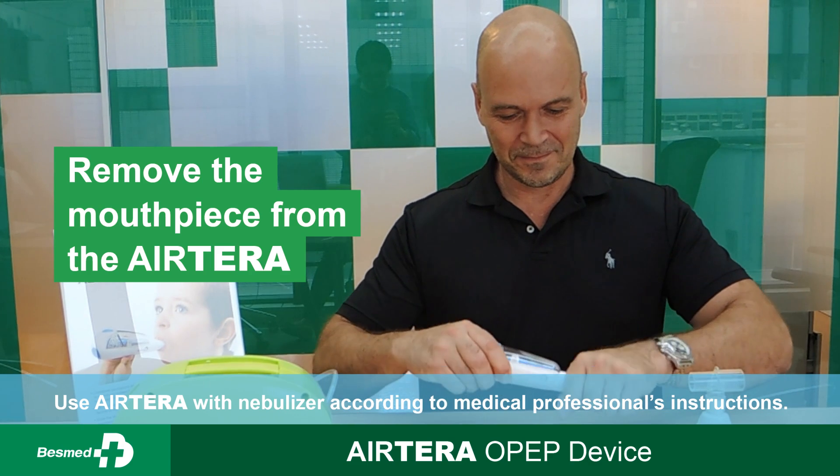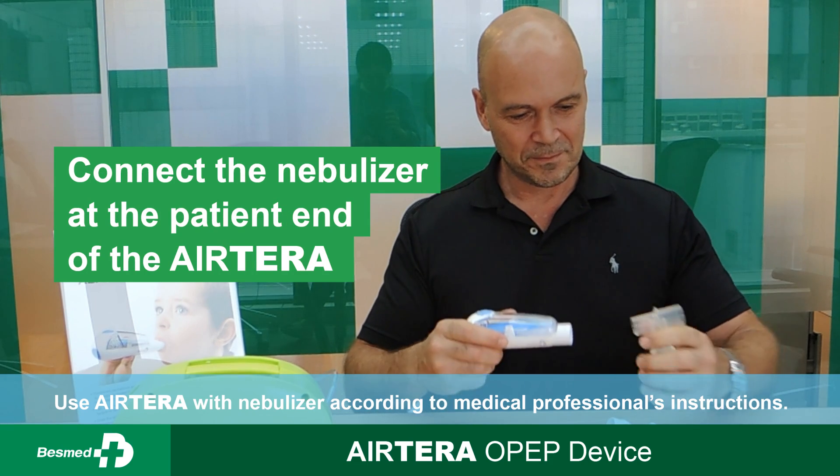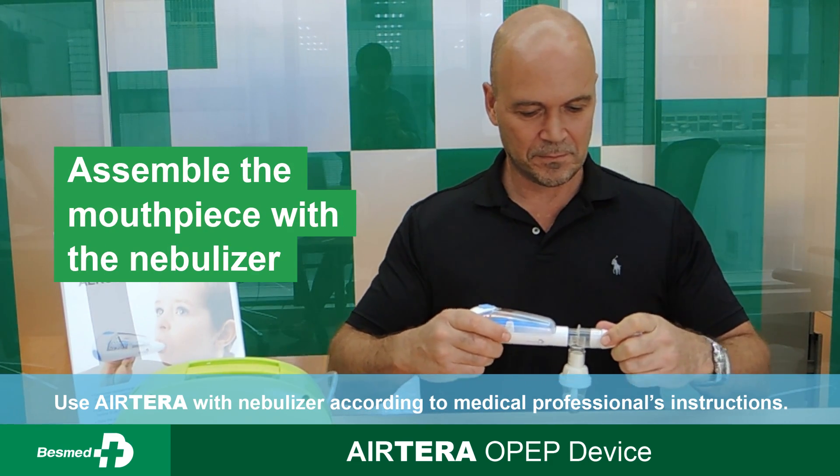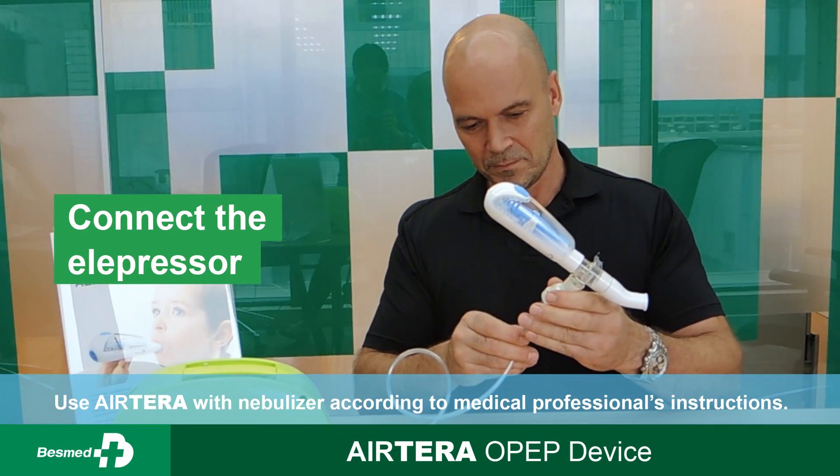To remove the mouthpiece from the AIRTERA OPEP device, connect the nebulizer at the patient's end of the AIRTERA OPEP device and assemble the mouthpiece with the nebulizer.